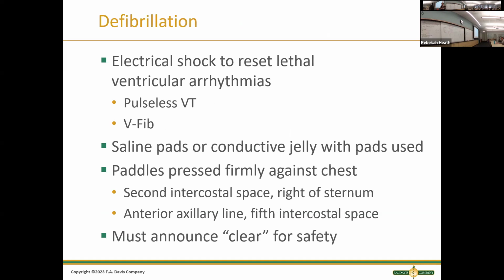We talked a little bit about defibrillation. This talks about paddles. I have not seen paddles used for 20 years. You use patches. Patches actually can adhere to the chest much better, and so that's what you want to use. We always want to announce clear for safety. Why do we do that? Right? Because what is the clear signal? Hands off, right? You don't say clear and shock.